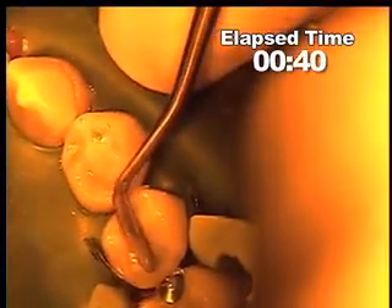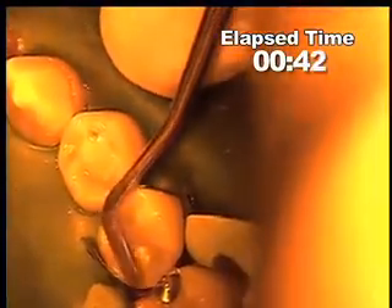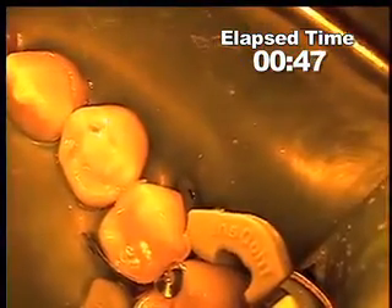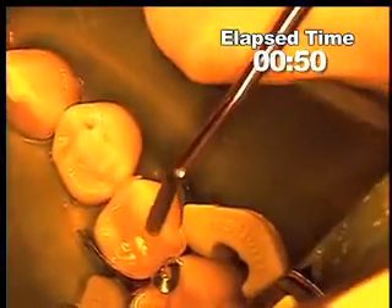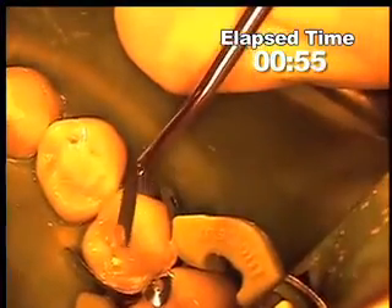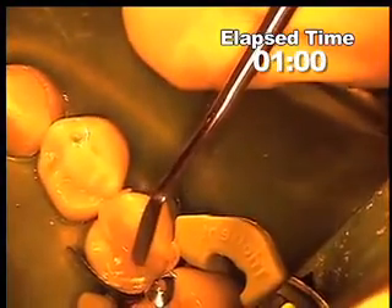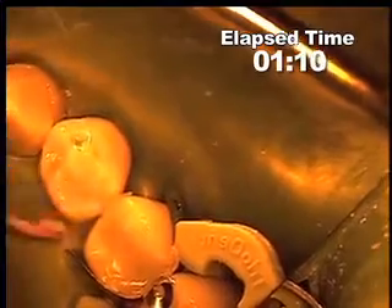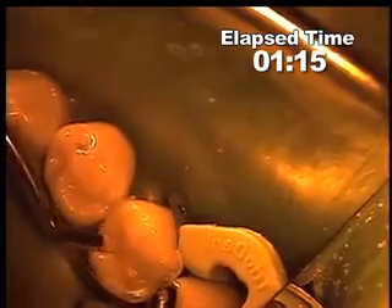I like to get my marginal ridge first and smooth that off down to the level that it should be, which is opposite the adjacent marginal ridge. What I really want to point out here is the fact that the material at this point has not returned all the way to its uninitiated state. It is easily carvable and very easy to work with and shape.